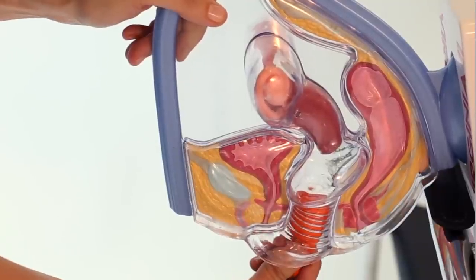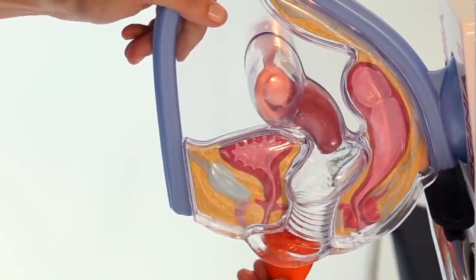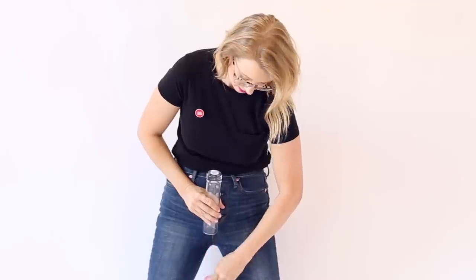Once you can reach the base of the cup, you're going to want to give it a pinch. This is going to help release the suction and make removal easier and more comfortable. While still pinching, pull the cup downward. Once you get it outside of your body, you should be over the toilet — keep it upright, then simply tilt it over and empty it.